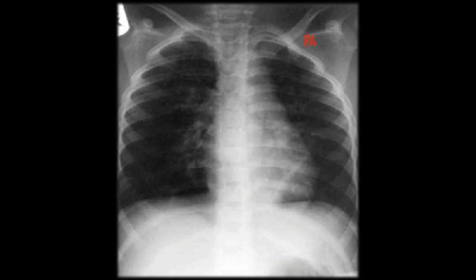And then the last thing we look at is is this an AP or a PA view? And this is definitely a PA view. I do not see the scapular markings in the lung fields. And so then we look at this from the pathophysiology standpoint, and we notice that we have hyperinflation. Our lungs are definitely hyperinflated. Heart silhouette is somewhat narrowed, not terrible. And we know with a PA view, we should have a normal size heart, 50% of the entire chest width as far as ratio goes.